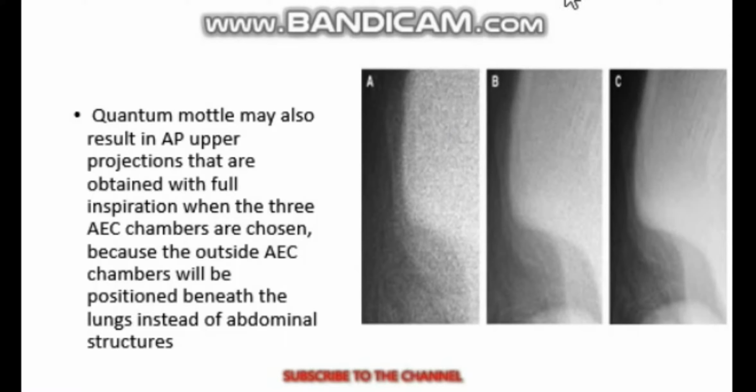So, quantum mottle is a type of radiographic noise directly related to the number of X-rays or photons exiting the patient and forming the radiographic image.